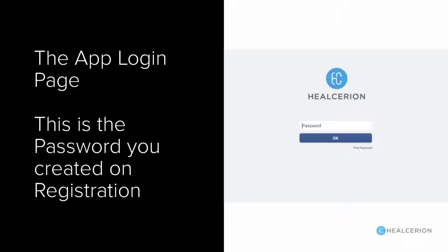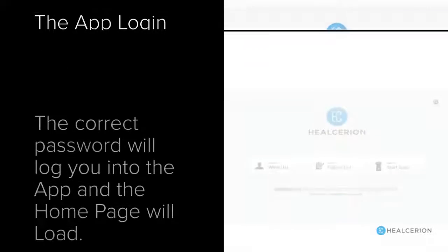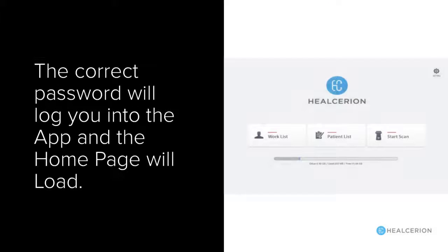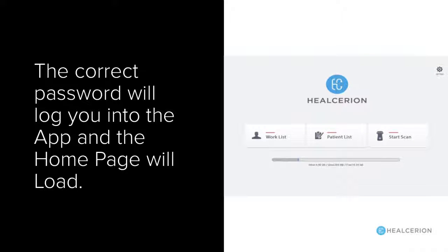Now that you're finished, you'll go to the login page, and this is where you would input the password that you've already created. Once you've logged into the app with your password, you will come to the home page of the app.